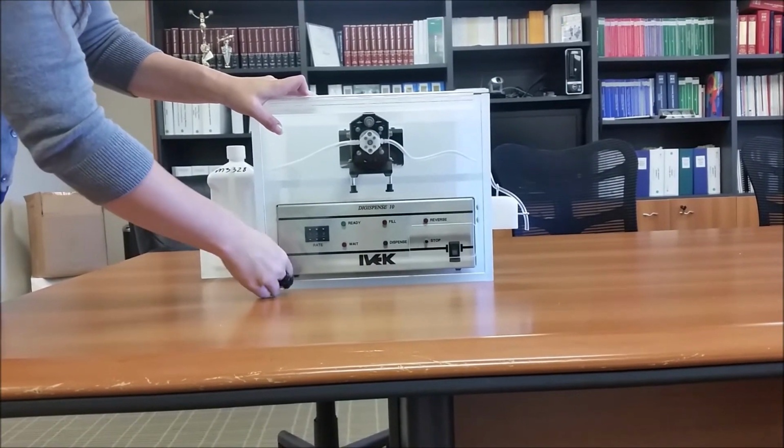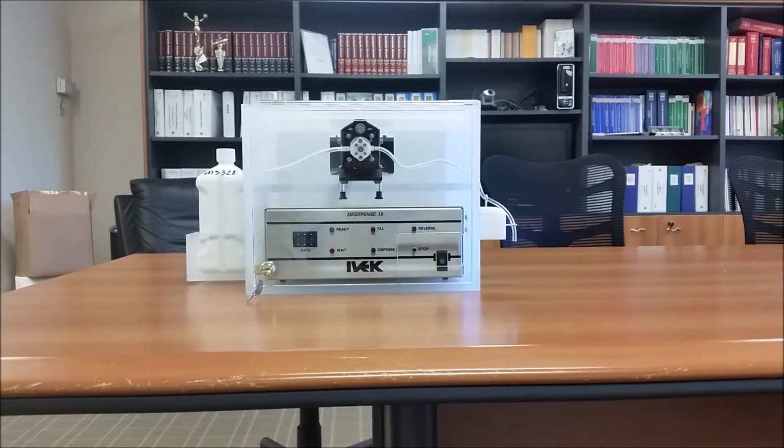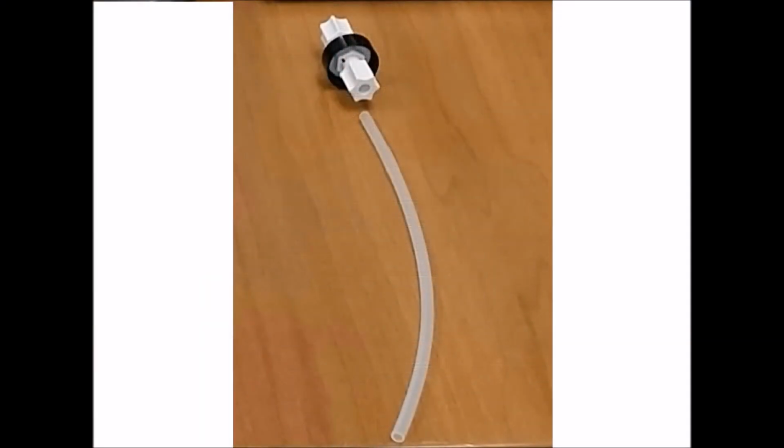You are now finished with the first part of the installation. Next, we will review the new way to attach the bottle to the pump. These pumps come with a bottle screw-on cap that has a straw that draws the medication from the bottom of the bottle. A small hole in the cap allows for proper suction.